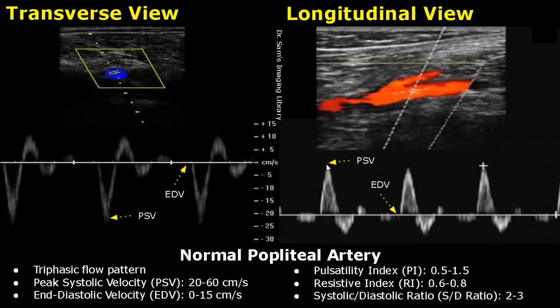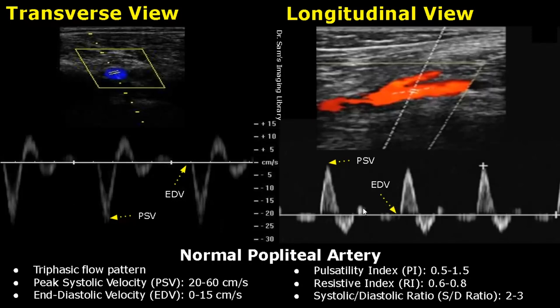It is triphasic because we see the waveform in three different shapes. The first phase is the systole — the wave is above the baseline and we can get peak systolic velocity. The second phase is the early diastole, seen below the baseline, which means there is some flow reversal. The last phase is seen above the baseline as well, but it is very small — sometimes it is also zero, which gives us the end diastolic velocity. It is the late diastole.